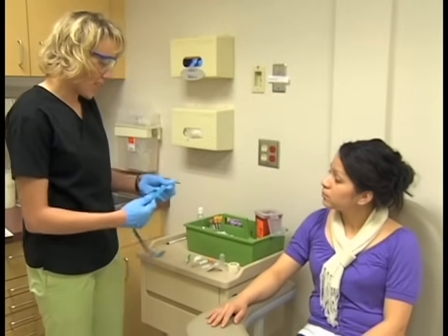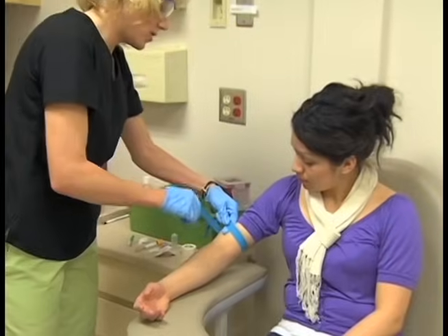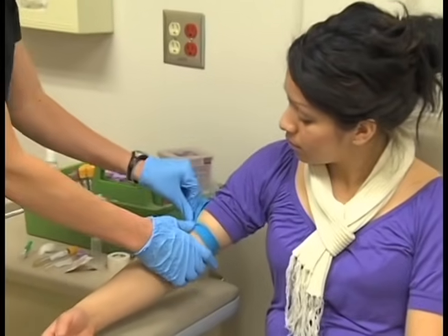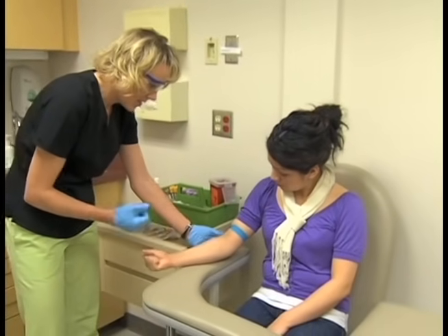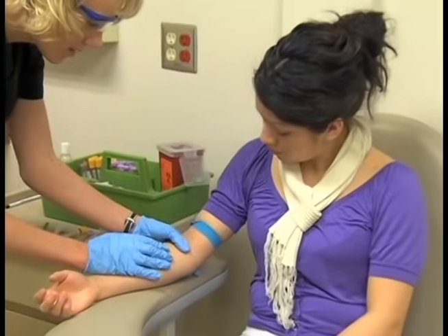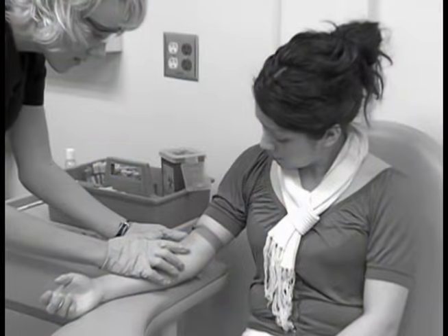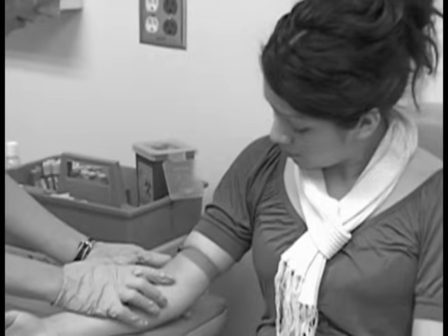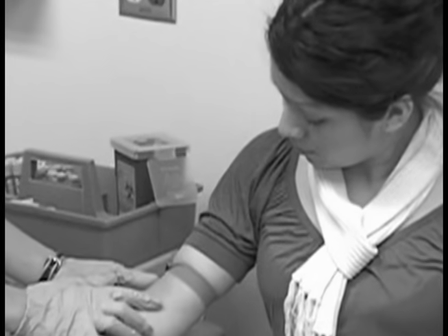An important step in the venipuncture procedure is the application of a tourniquet. The tourniquet makes the patient's veins stand out so they are easier to palpate — it acts as a dam, causing venous blood to slow down and pool in the veins, making them more prominent and visible. The tourniquet should be applied with enough tension to slow venous flow without affecting arterial flow. A tourniquet that is too tight obstructs both venous and arterial flow, which may produce inaccurate test results. Never leave the tourniquet on an arm for more than one minute at a time.